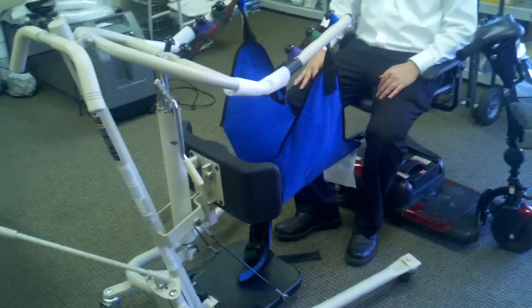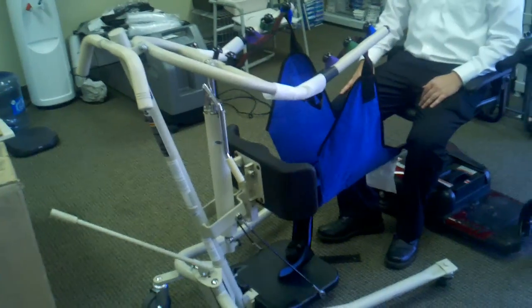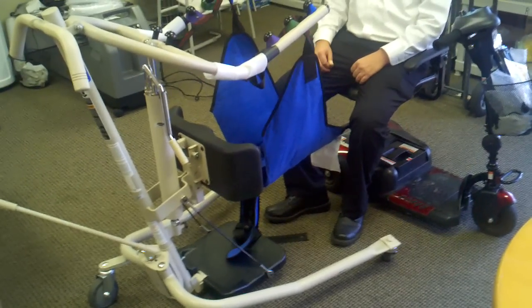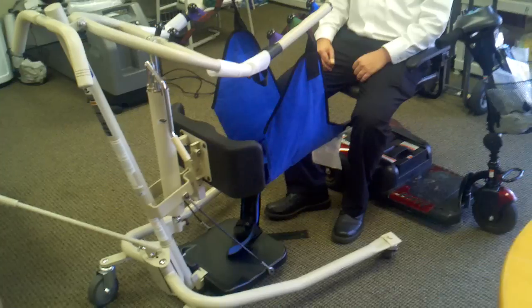We have an individual here and he's going to be assisting in demonstrating what it's going to be like to get a person moved from a wheelchair, a hospital bed, a scooter or whatever — someone who can't move their legs or is very fragile and needs a lot of help.